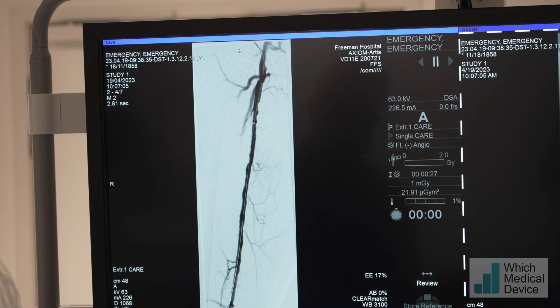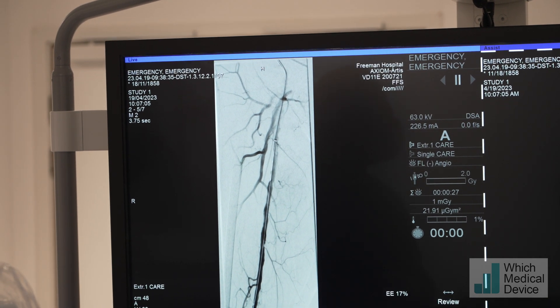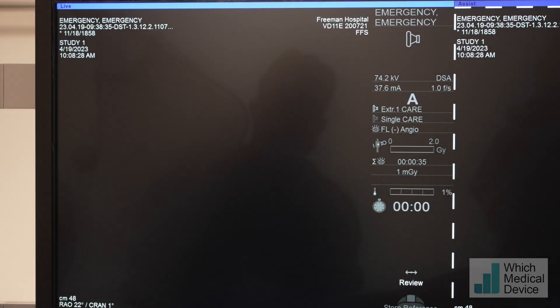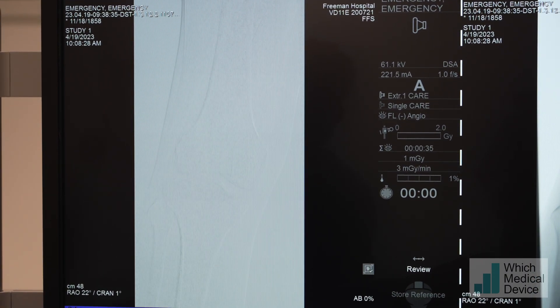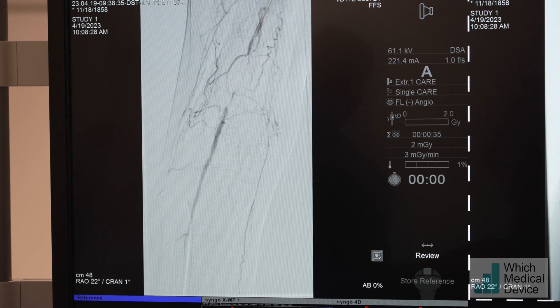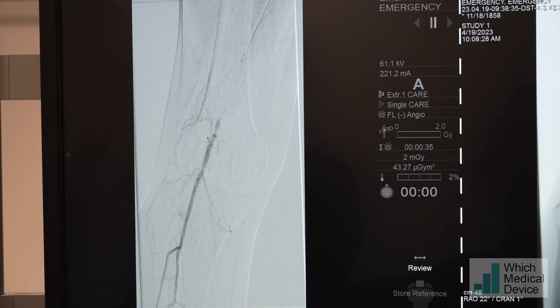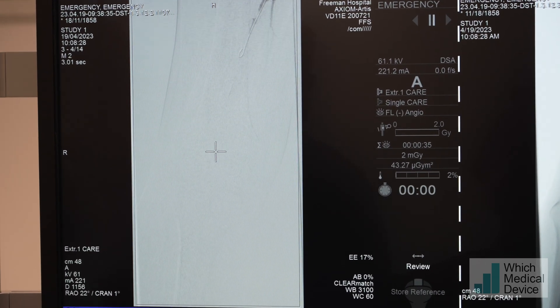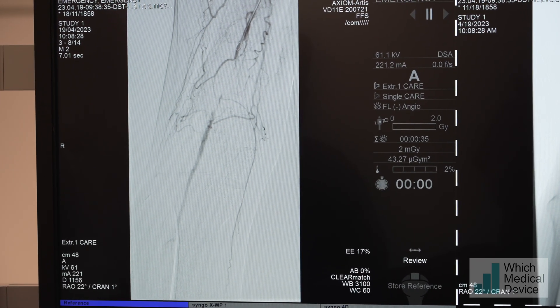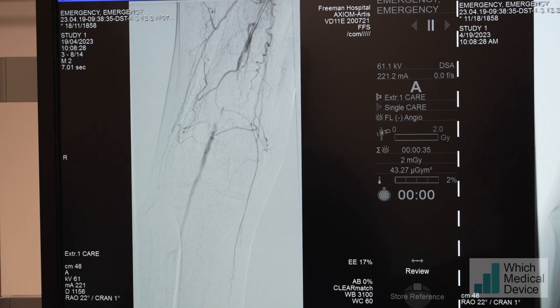It's not the SFA - it looks very good, doesn't it? Diffusely diseased but no focal significant stenosis. Let's go lower down. As expected from the ultrasound - can we overlap and go south? It's basically an occlusion - looks about a five centimeter occlusion of the popliteal artery, just after the adductor hiatus, which is exactly what we thought it would be.